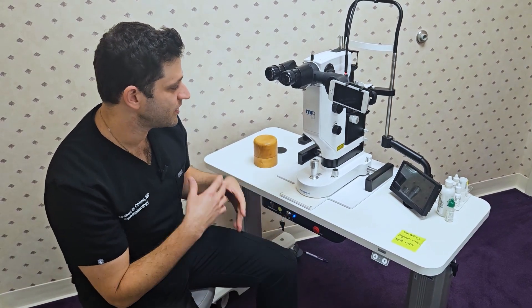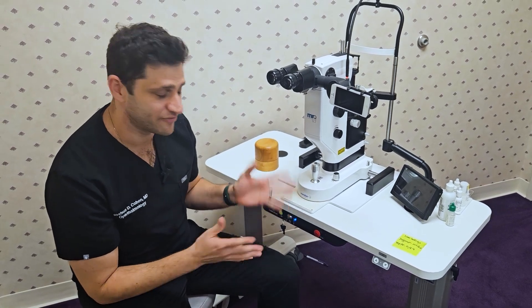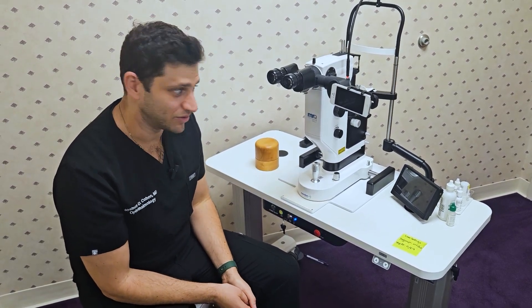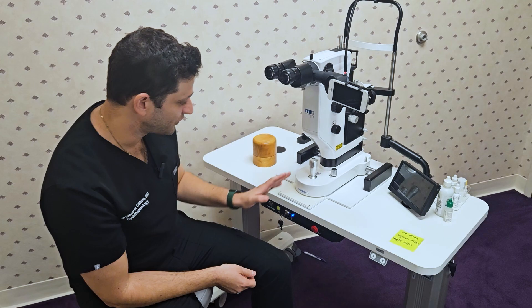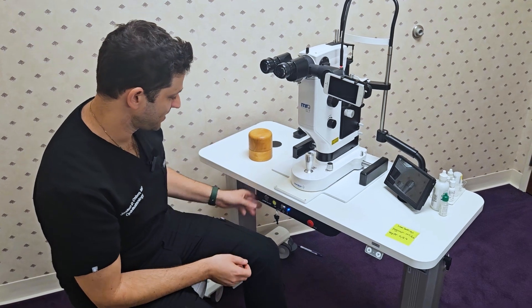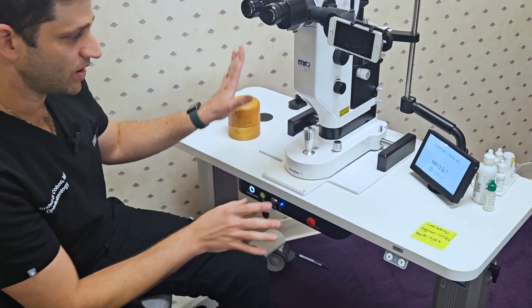I want to walk you through the setup and how to adjust your settings, because it's very intuitive, but it never hurts to have a little tutorial. So the first thing is obviously you plug everything in, and this main button here will turn on the laser and the scope all in one.